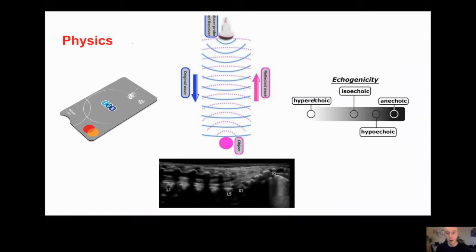There are things that are hyperechoic, that reflect sound waves well, and these are things like bone, and they appear bright white. This is a sagittal image of someone's spine. This is an epidural hematoma, and you can see here the spinous processes, and here are the vertebral bodies. These are bright white. Things that are black are air, which doesn't transmit sound waves, and fluid. And here you can see this is the hematoma. And underneath the bone is also black. This is just shadow, because there's nothing underneath that bone to reflect, because the bone has reflected all of it.